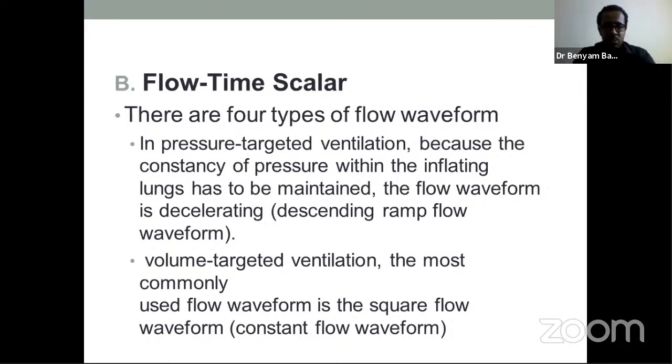In pressure targeted ventilation, because there is a consistent pressure within the inflating lung, the pressure has to be maintained within the lungs. The flow waveform usually is a decelerating or descending ramp flow waveform, which I'll show you on the next slide, what it looks like.